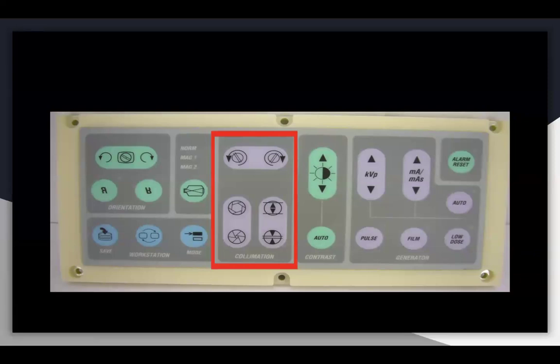If the doctor really wants to get a good look at L5S1, you can make it like a spot film and cone down to just have that circular view of that area. And your other collimation basically lets you open it up top to bottom, if you need to collimate that way, and these buttons allow you to open it from side to side.